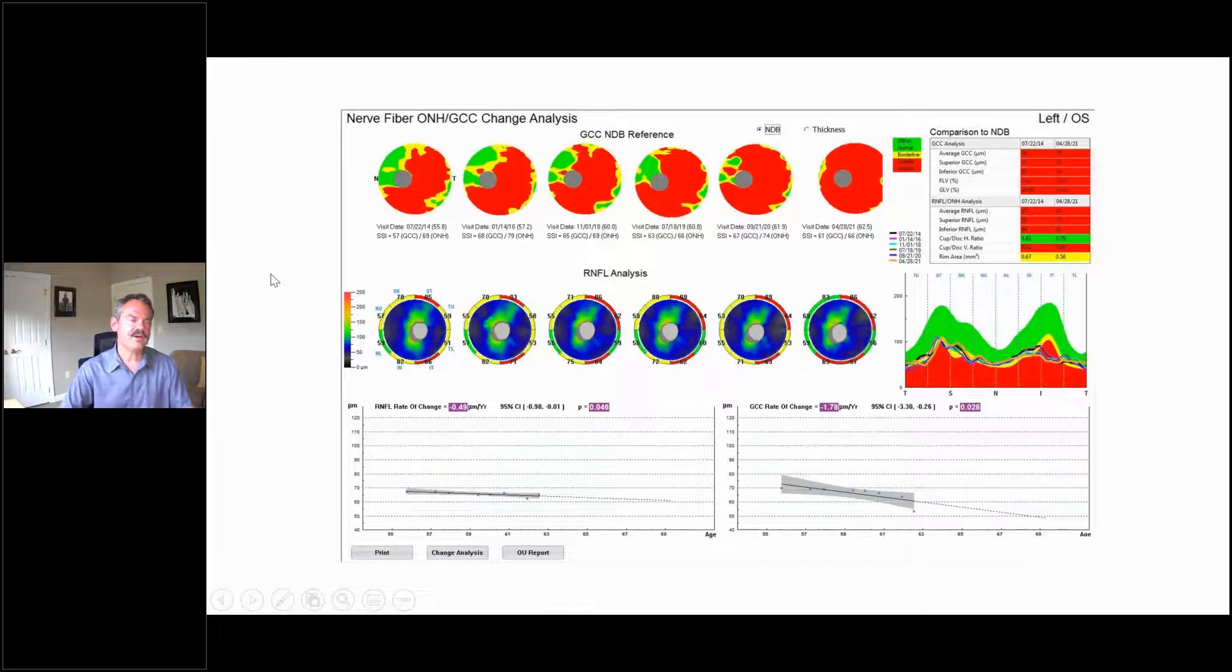The left eye OCT does not look nearly as good. We can see the ganglion cell complex is really washed out. We're getting red across the board.